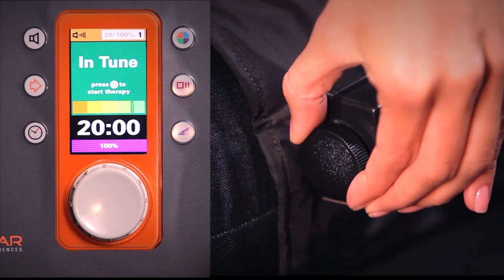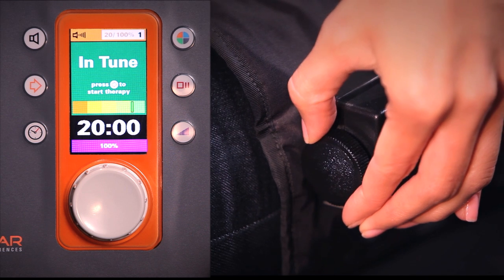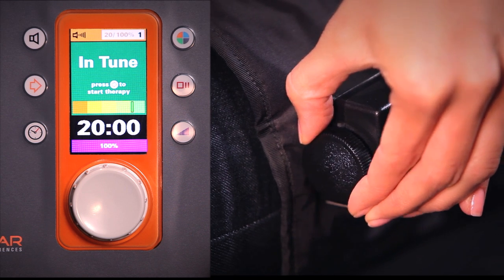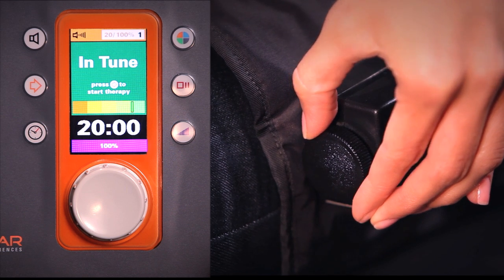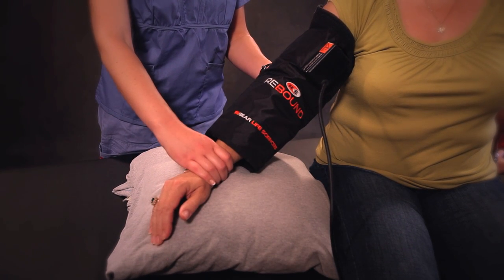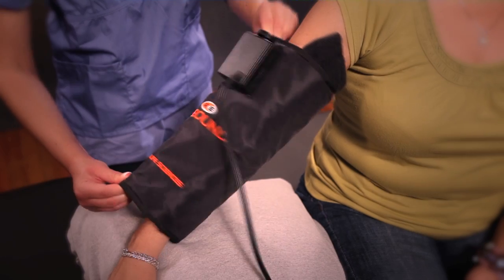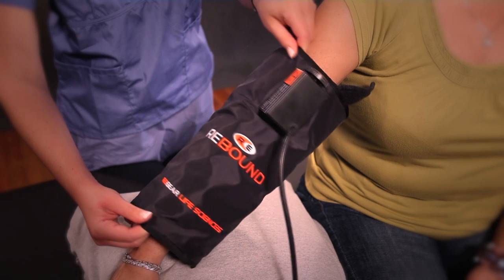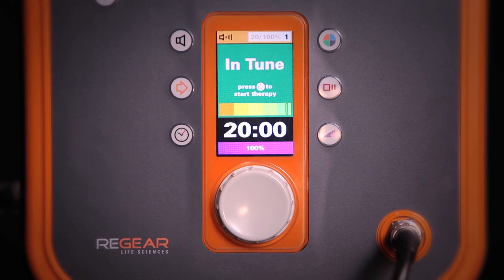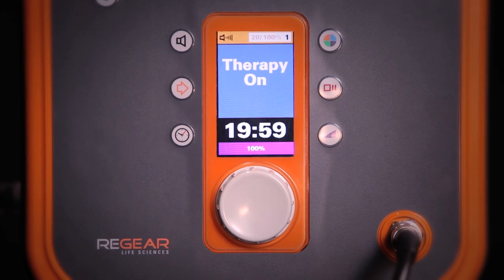If you find that you are in tune, but the indicator bar is just barely over the line into the green box and turning the knob isn't improving the position of the bar, try the following tips to get an even better tune. Change the person's position slightly, move the garment up and down, twist the garment right and left. Once the patient is in tune, press the continue button to begin therapy.